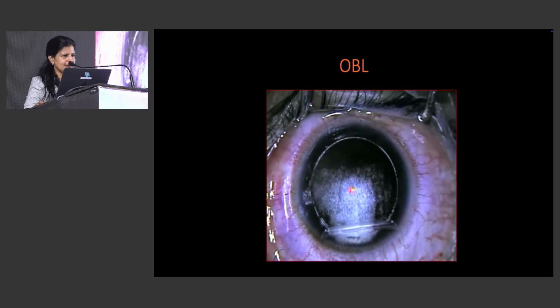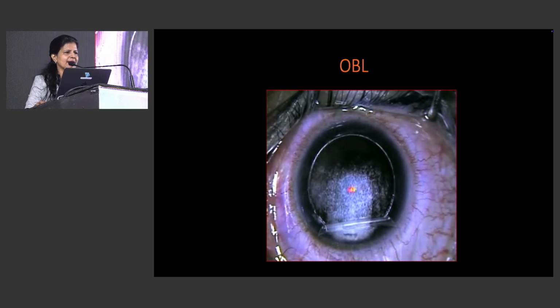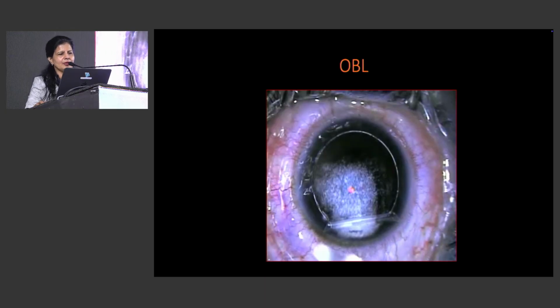Sometimes eye tracking may be a problem. The amount of laser, the fluence of the laser when it reaches the bed may not be actually what shows up on the screen.